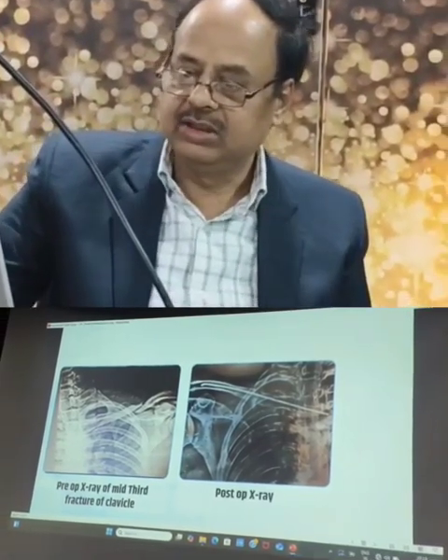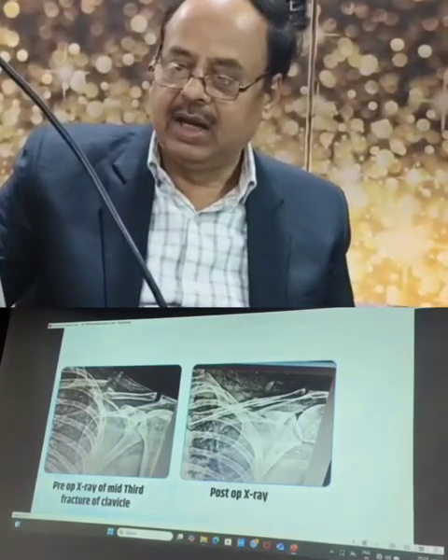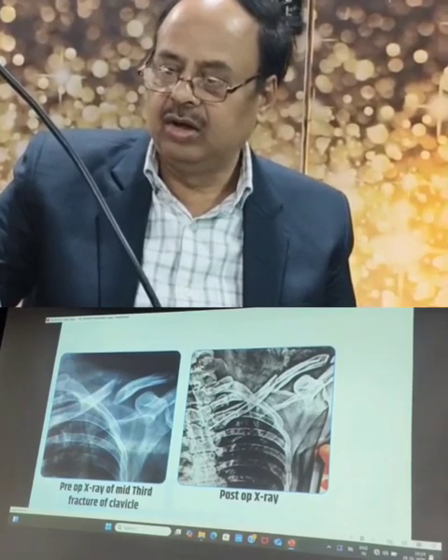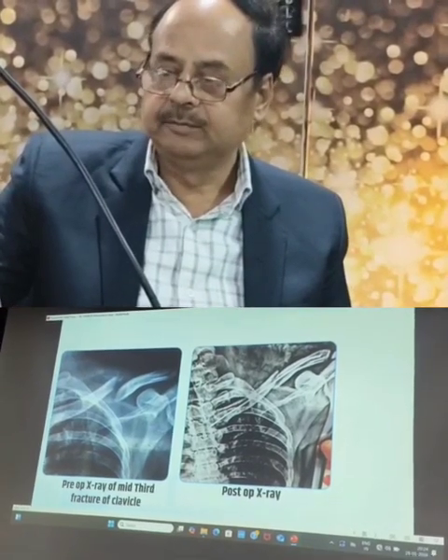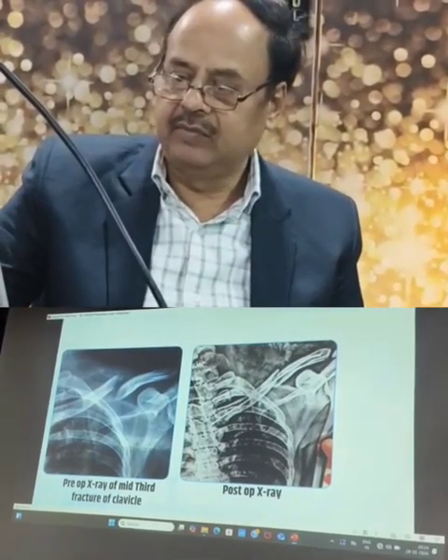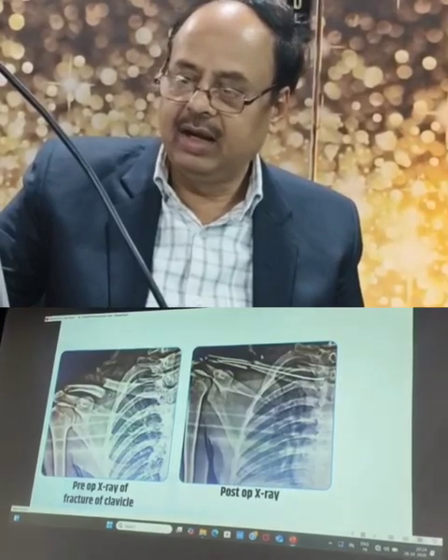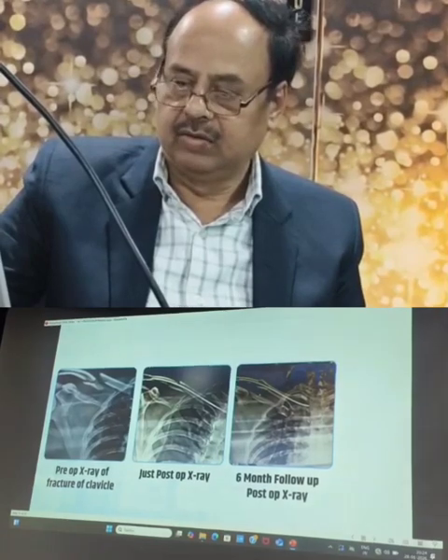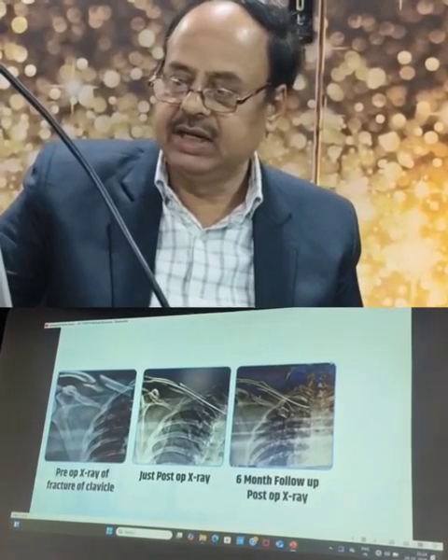So this is another case of a mid-third fracture treated by titanium elastic nailing. Yet another case, a 15B1 fracture treated by titanium elastic nailing. Yet another case of a 15B2 fracture treated by titanium elastic nailing. And this is again a 15B2 fracture treated by titanium elastic nailing. And this is a 15B3 fracture.